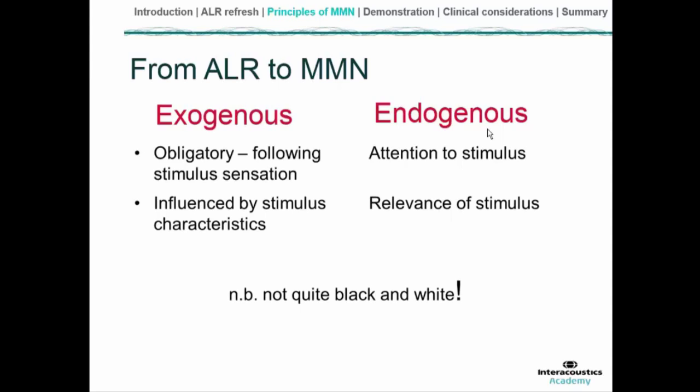Suddenly, if a louder sound comes in, your attention is drawn to it, but that attention will differ according to how much louder the new sound is compared with the old one, for example. But as I mentioned, the MMN is under the exogenous category, and we're going to concentrate on recording conditions with passive attention only, with no particular active attention needed to the sounds.